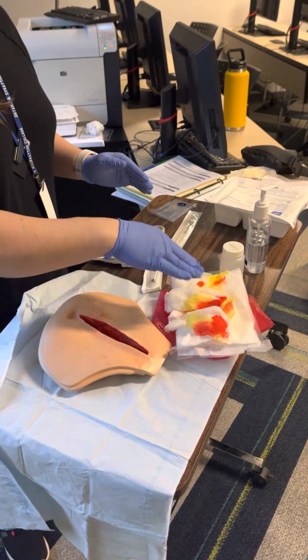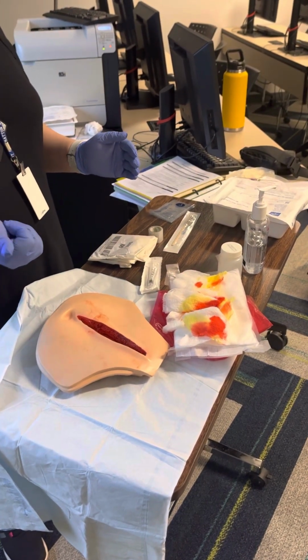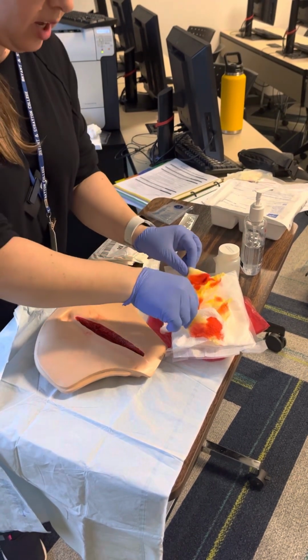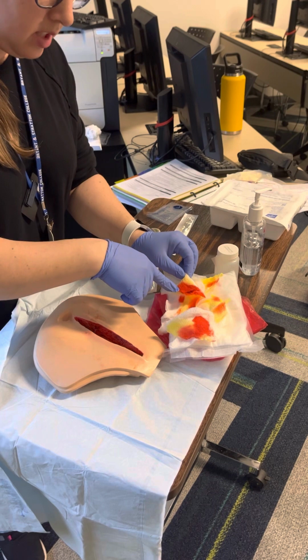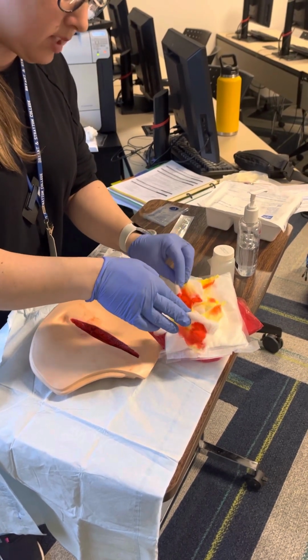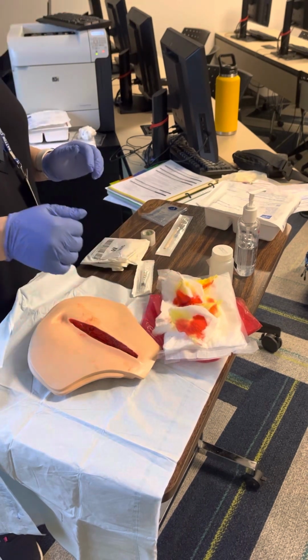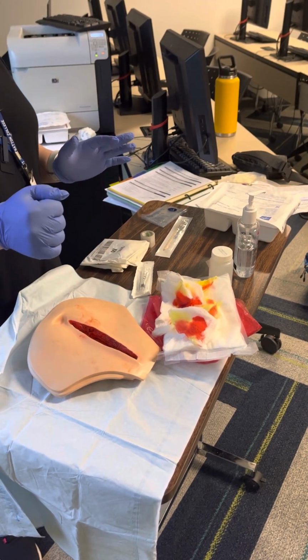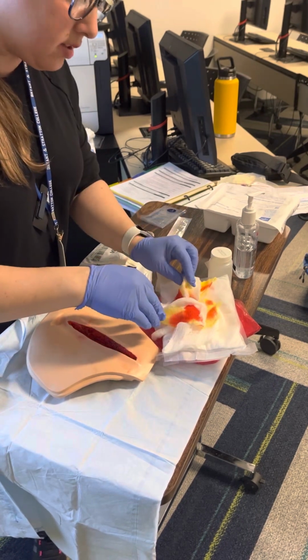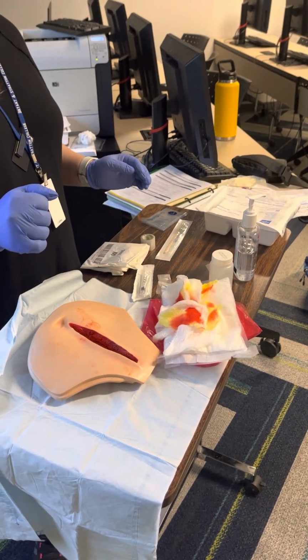When I was looking at my dressings as I was taking them out, I didn't see any exudates, no pus inside. I'm gonna look at the drainage. The drainage looks like it's serosanguinous because it's bloody, sanguinous, and then serous because it's got this yellowish white or clear fluid. The amount of the drainage, I would say based on the amount of gauze, is moderate, maybe large amount of drainage.